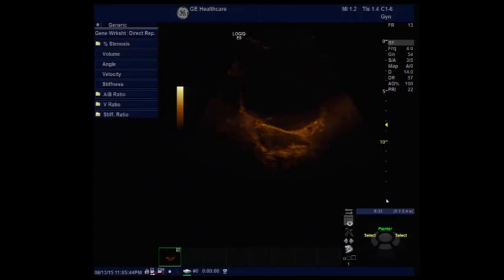In pediatrics, assessing ureteral jets can be part of the protocol when doing a renal scan. B-Flow can assess the ureteral jets in the bladder as seen on this image. Now we will demonstrate how to optimally scan a few of these areas.